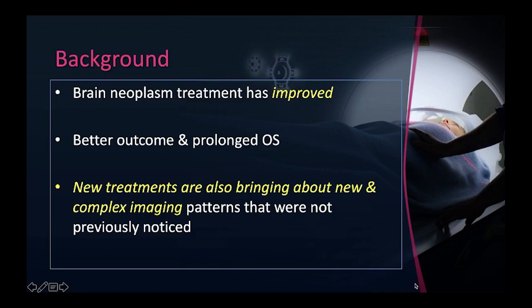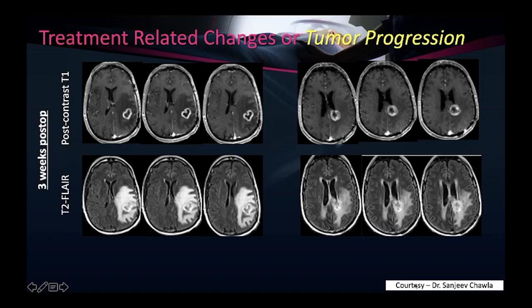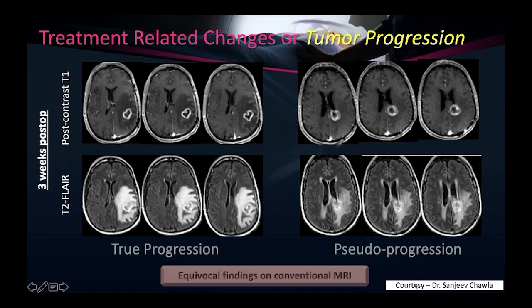As a background, brain neoplasm treatment has improved over the years, leading to better outcomes and prolonged overall survival. But these newer treatments are also bringing about new and complex imaging patterns not previously noted. I'm showing two follow-up glioblastoma cases — top panel is post-contrast T1, bottom is T2 FLAIR — and the enhancement pattern and extent of FLAIR edema look very similar, yet one patient has recurrent tumor (true progression) and the other has treatment effects known as pseudoprogression. Conventional imaging findings are thus somewhat equivocal.